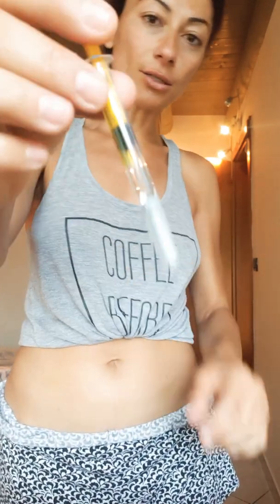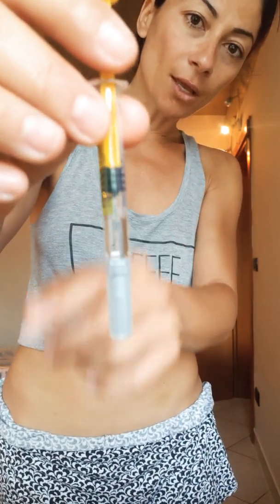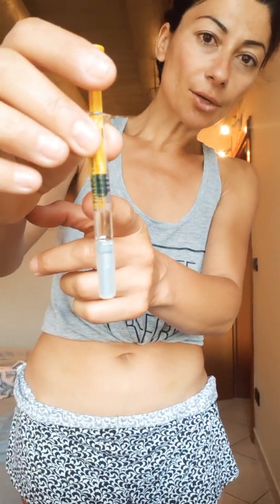I washed my hands and I'm going to clean the area — I'm going to do it on this side. And do not take the bubble out; there's a bubble of air inside. You ideally want to have it on the top portion. Don't remove the air — I know it sounds weird, but don't remove it.